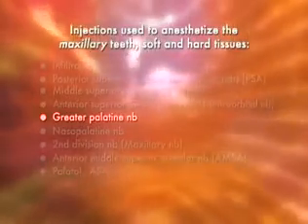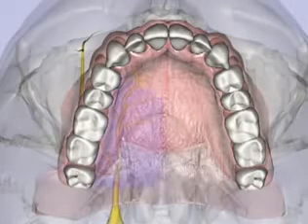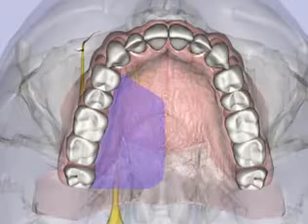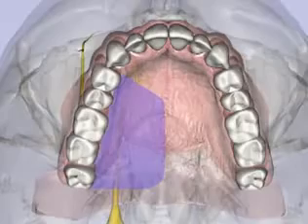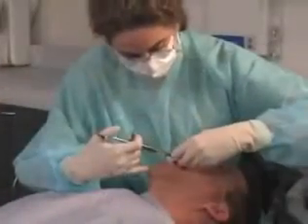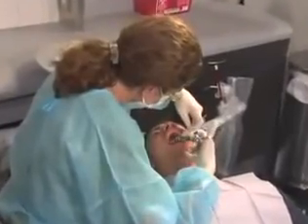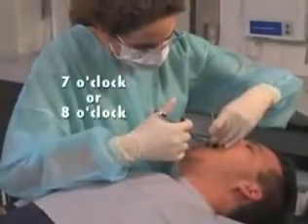The greater palatine nerve block, also known as the anterior palatine nerve block, provides anesthesia to the posterior portion of the hard palate and its overlying soft tissues anteriorly as far as the first premolar and medially to the midline. A 27 gauge short needle is recommended. For the left greater palatine nerve block, the right-handed operator should sit facing in the same direction as the patient at the 11 o'clock position. For the right greater palatine nerve block, a right-handed operator should sit facing the patient at the 7 or 8 o'clock position.